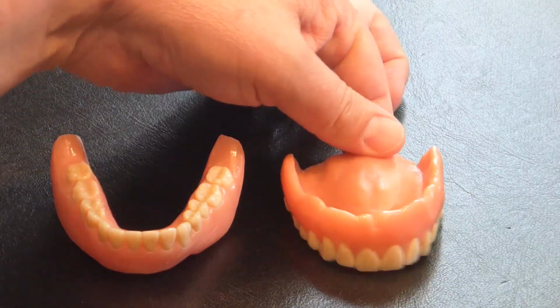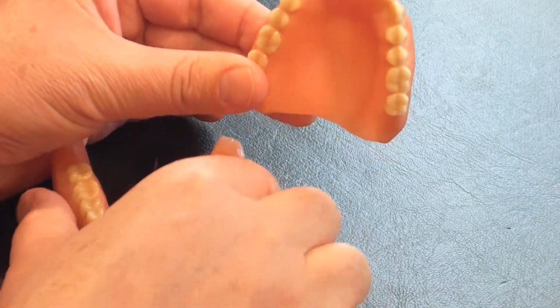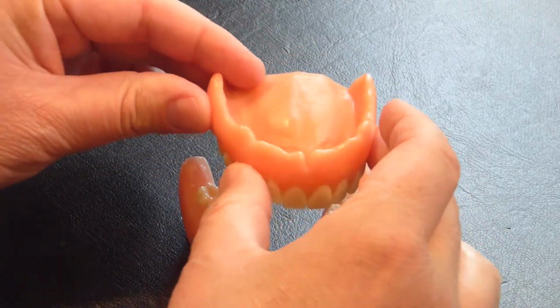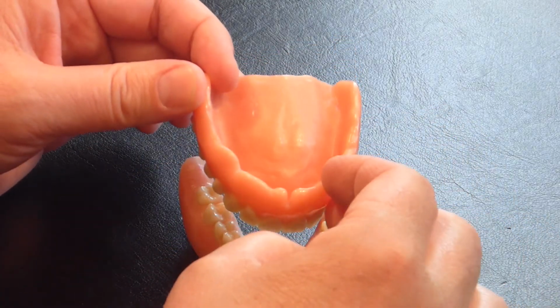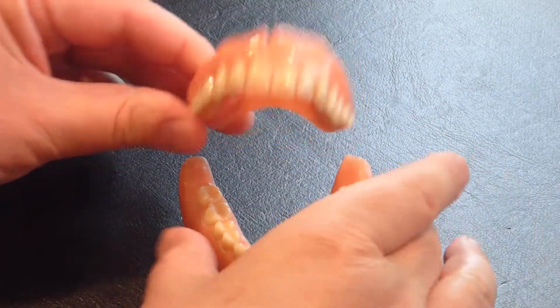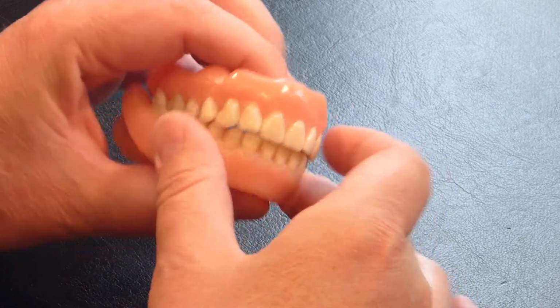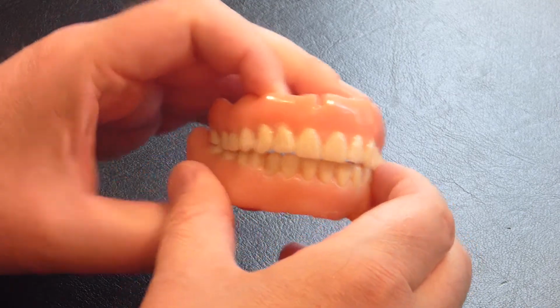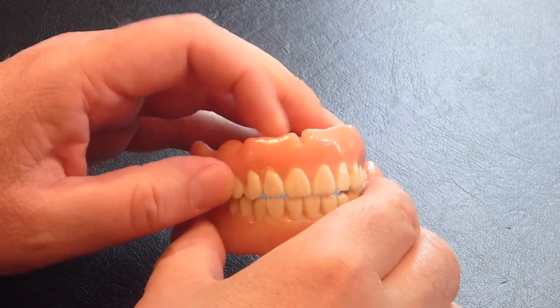Pros and cons of dentures. Because dentures are plastic and they move around, no matter how well of a fit you get, there's always going to be some movement since there's no attachment between the denture and your gums. They will always tend to move, and because of that, you won't be able to bite as strongly as you could when you had your natural teeth.